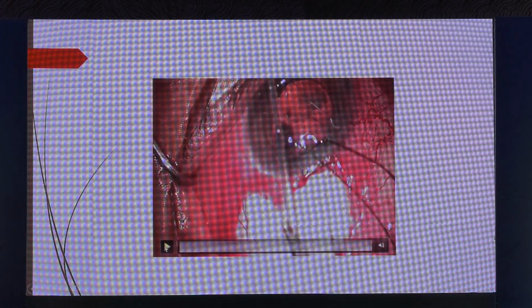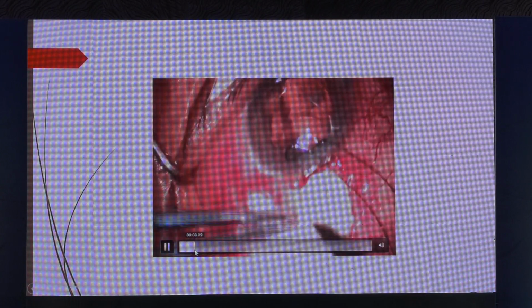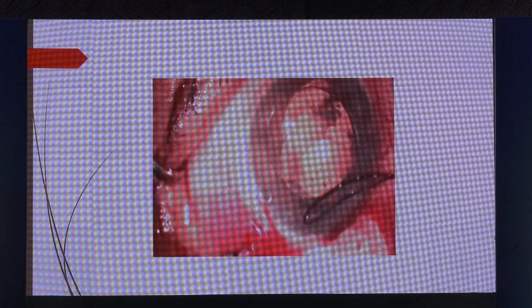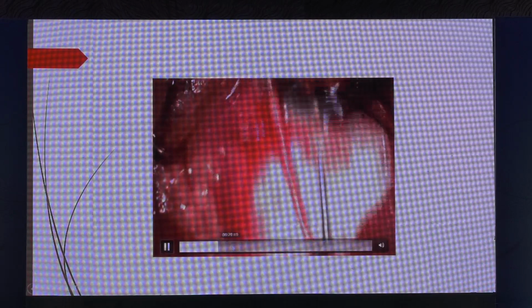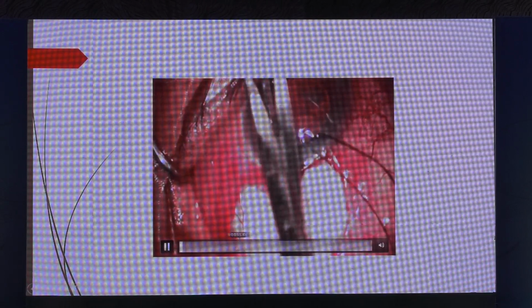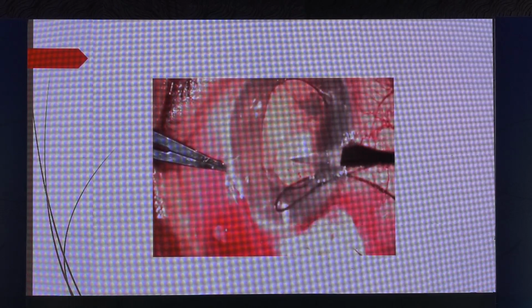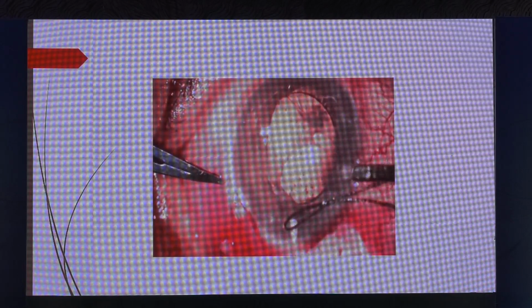Sometimes you do get problems on table when there is extensive PAS and it is not possible to put the tube in the sulcus also. This patient was a traumatic glaucoma patient with the ACIOL being put in the posterior chamber, and there was a rent which was seen, and one failed trab. So it was not possible to... you can see here there was a lot of PAS. So what you can do is just make another port and try to release this PAS with iris repositor.